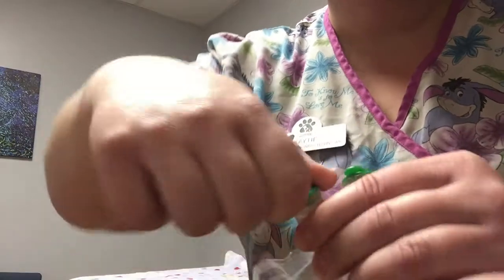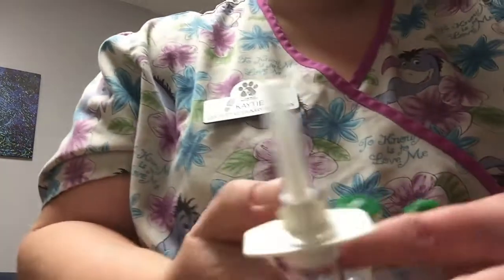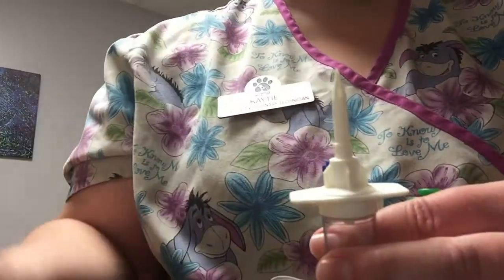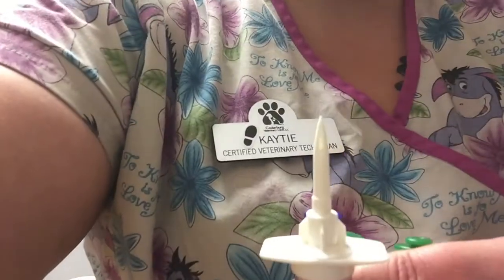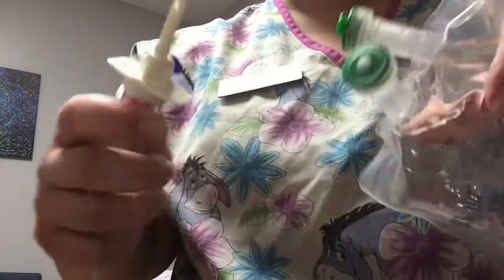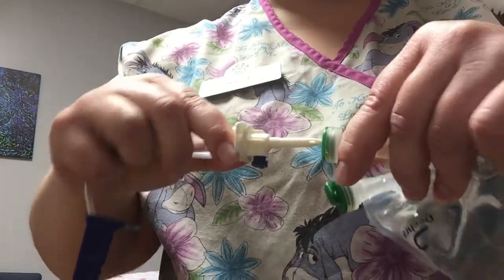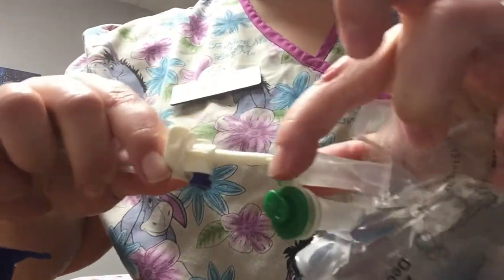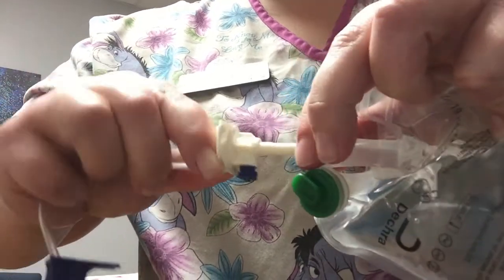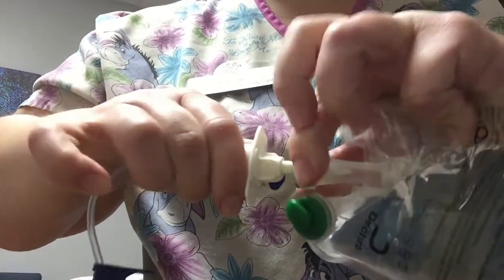We're going to peel one of these off — they just snap off. There's a spike with a nice little cover on it. Don't be fooled, these are kind of sharp, so don't poke yourself. When you line it up, make sure you line it up pretty well because you can accidentally puncture the bag. You're going to poke that straight through.